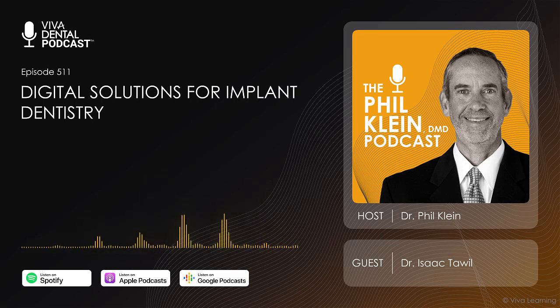And then, of course, in terms of the ability to have tracking, for example, if I'm scanning on the right side of the mouth and I move over to the left side of the mouth and I want to jump back to the right because I see that there's something off, I don't want to wait 30 seconds for the scanner to try to find it. It should be instantaneous, where it just picks up where it left off. And some of the scanners can do that, some can't.